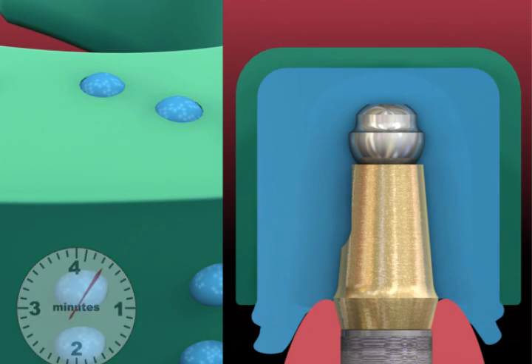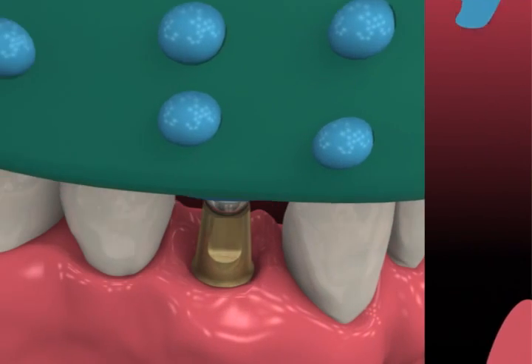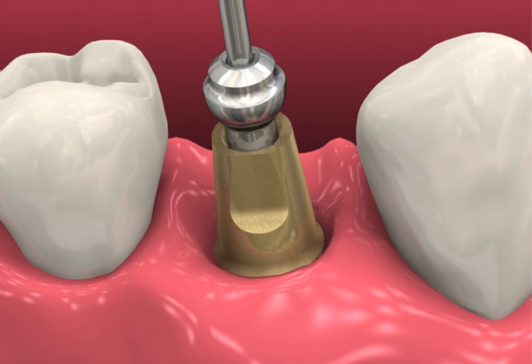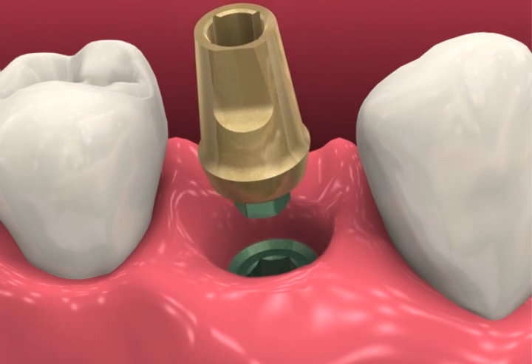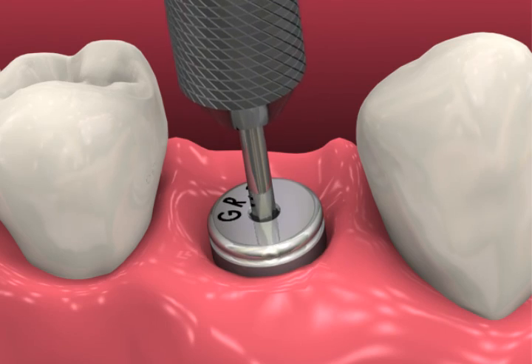Record a full arch impression with a tray loaded with the same or heavier bodied material. After the material sets, carefully remove the tray. Unthread the ball top screw, remove the 3-in-1 abutment, and replace the healing abutment. If desired, a provisional prosthesis may be fabricated using a peak plastic temporary abutment.